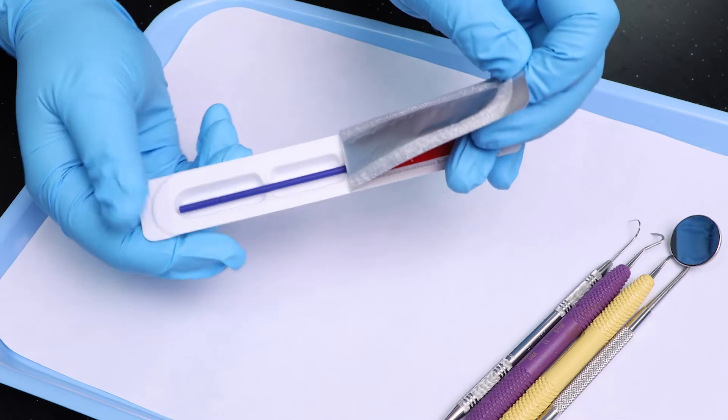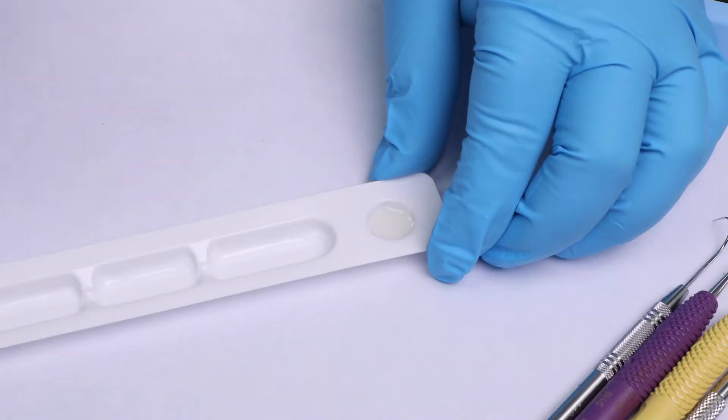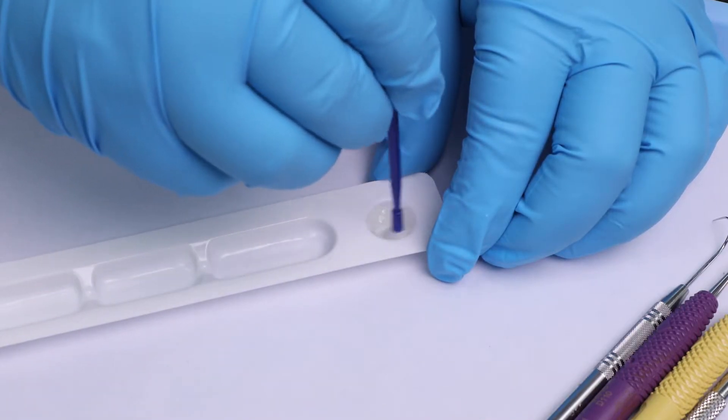For unit dose delivery, open the blister pack by peeling back and removing the foil lid. Lightly stir the varnish.